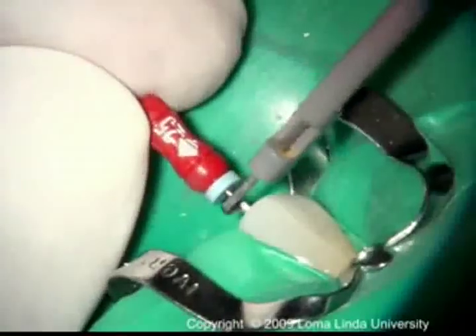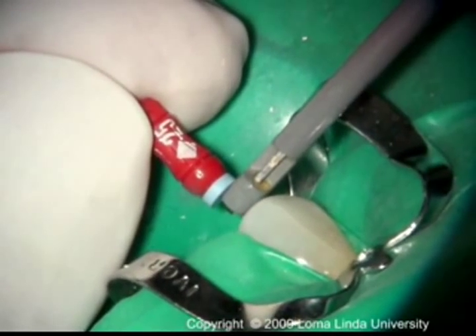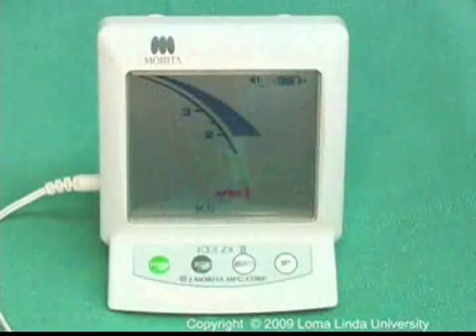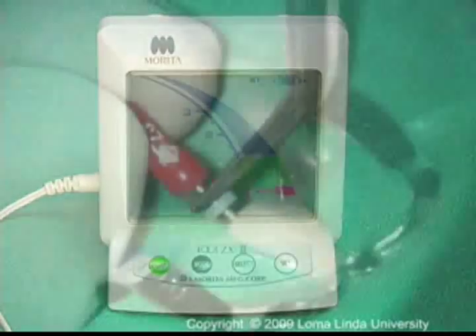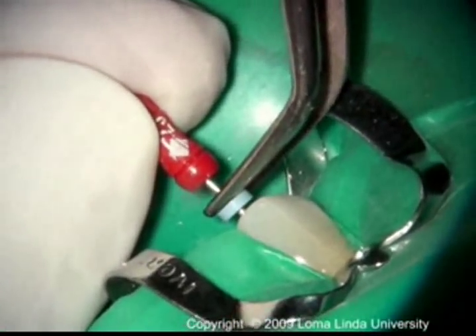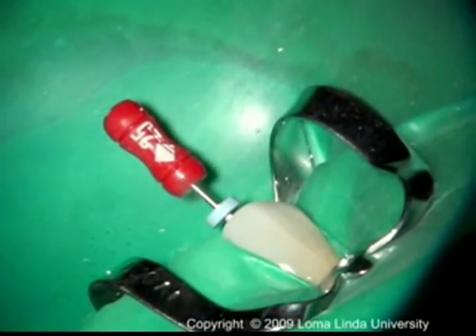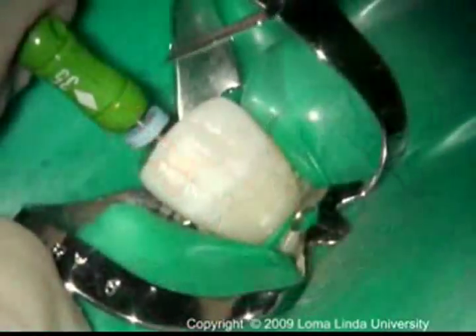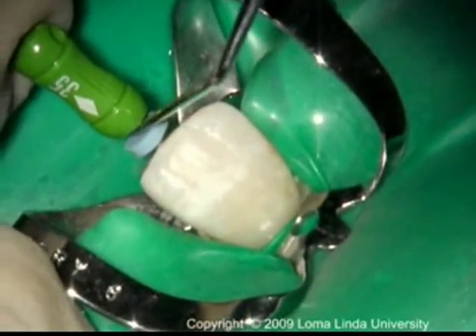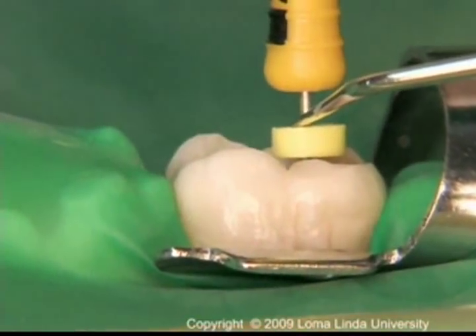The file holder from the apex locator is attached to the file and it is then moved towards the apex. After the file tip reaches the apex and the reading is stable on the apex locator screen, the stop is adjusted to coincide with the reference point. The reference point must be stable so it will not change between appointments. The reference point can be the incisal edge in the anterior teeth or a cusp tip in posterior teeth.